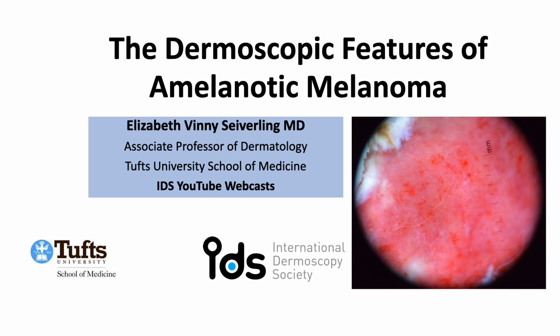I'm Vinnie Seiverling, and I'm a dermatologist at Tufts University in Boston, Massachusetts, in the United States. Today, I'll be talking with you about the dermascopic features of amelanotic melanoma.